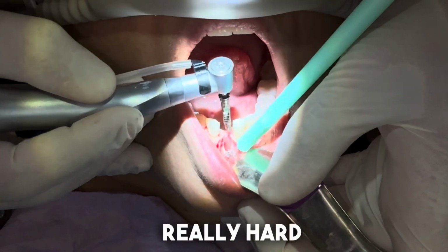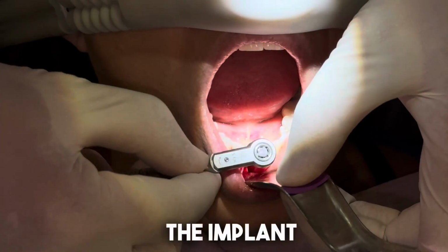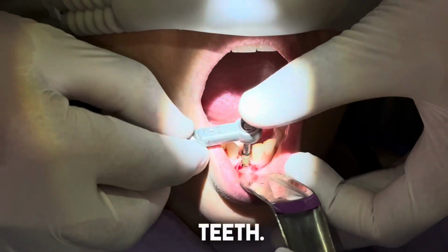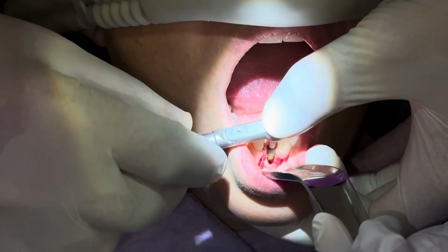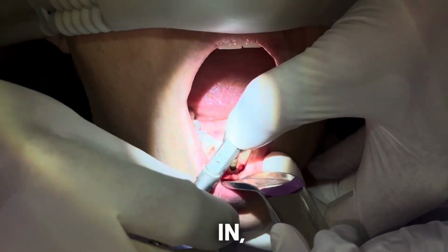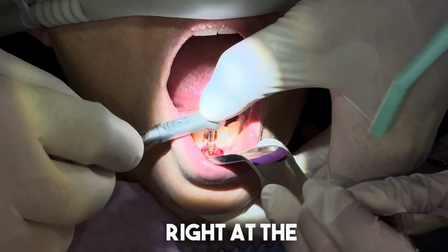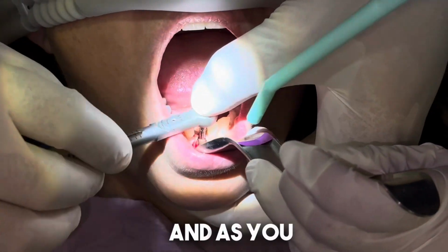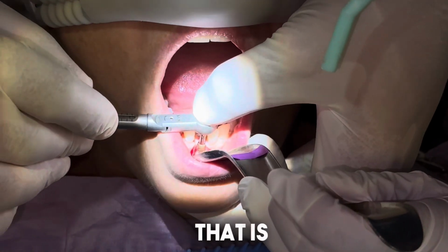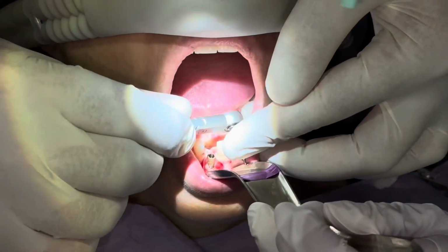These are really hard implants to place because you're trying to safely place the implant, not disturbing the adjacent teeth. So now we're going to tighten that implant in. As it goes in, it kind of disappears and seats right at the length that we wanted. And as you can see, the implant that is exposed, the surface, we got a good torque there.